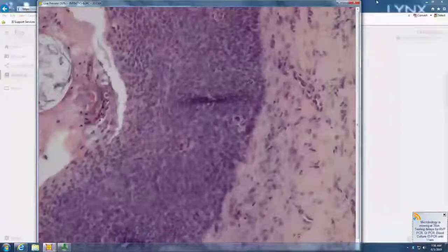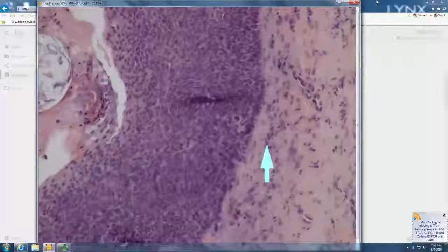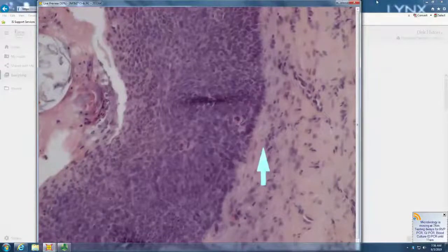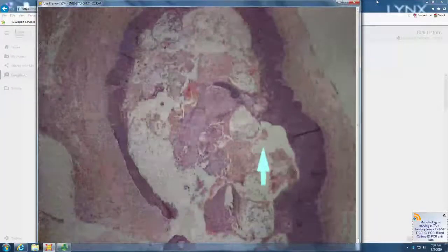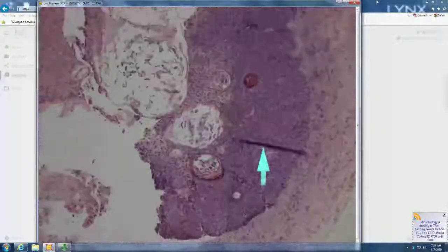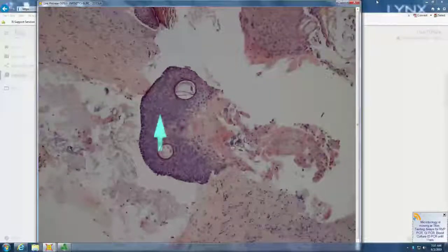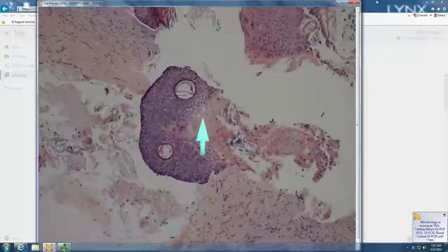So not poroma. So blue cells, peripheral palisade, fibroblast-rich stroma surrounding puts it in the pilar group. Sweat gland group don't palisade. Pilar tumors palisade. Okay. So it's a cystic pilar tumor with horn cysts, and if you look at different areas, it can look like germinal epithelium.